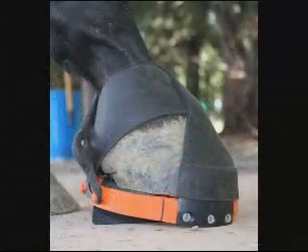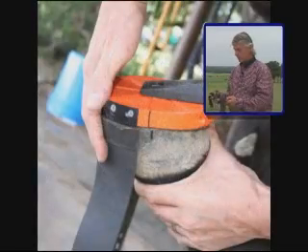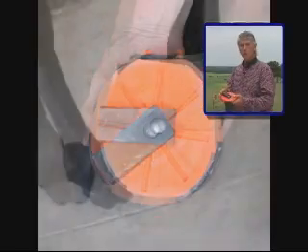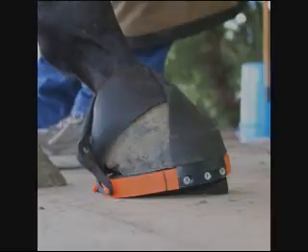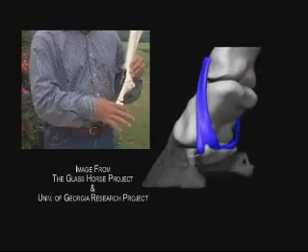This is a device that's strapped on the bottom of a horse's foot, and we like to have the center's pivot point close to the center of articulation. The straps go around the ankle and surround the pastern area and then attach to the back side, so it's basically strapped on. Once it's held in place, this dial on the bottom can be moved to different positions from the ground surface, and it elevates the foot in this direction. Then we swing this around to the opposite position to get a counter-reference. We work around the bottom of the foot in eight different directions — diagonal corners, front to back, side to side, and then on the quadrants in the quarter section of the foot. Basically, we're challenging the structures inside the foot, the connective tissue for the most part, and the joint itself.